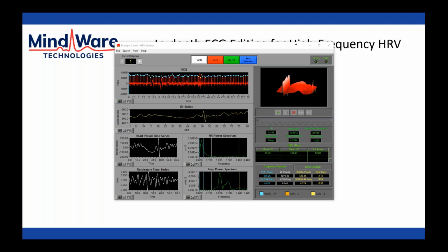Cardiac impedance is much more challenging, because one of the electrodes goes right there in the xiphoid process where the ribs meet, and that's generally where you're going to find chest hair present on male subjects if you're running into that problem. So in general though, if you need to offset the electrodes slightly to avoid particularly hairy areas, that is possible, as long as you are not offsetting them much, and as long as you're previewing your data before you acquire, to make sure that you're still seeing the expected morphology.